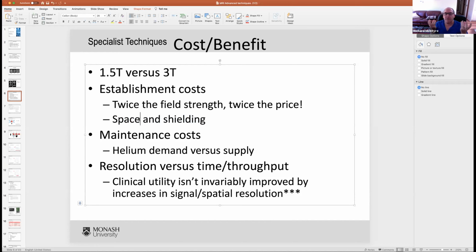We're also going to have the possibility of having a stronger spatial gradient, all right? You can imagine that the spatial gradient has to get from 3T down to 0.5 Gauss, or 5 Gauss at the door, okay? If you compare that to a 7T, then that drop off is going to be a lot sharper with a higher field strength.